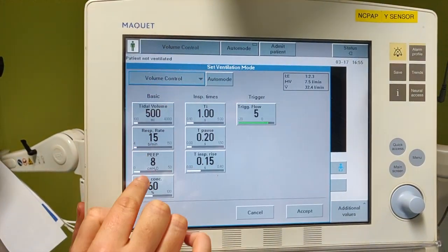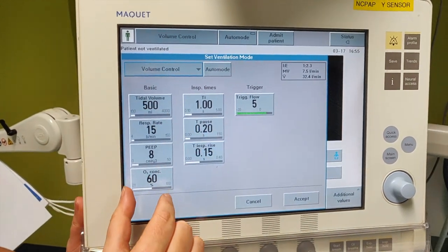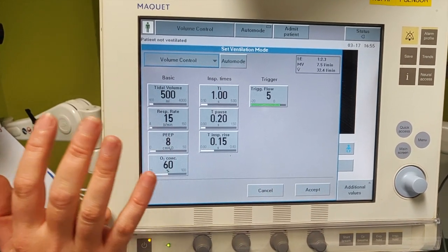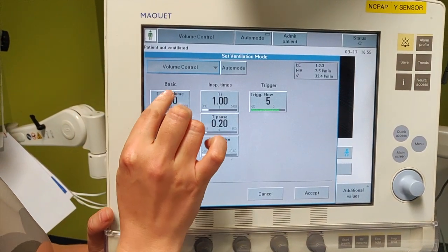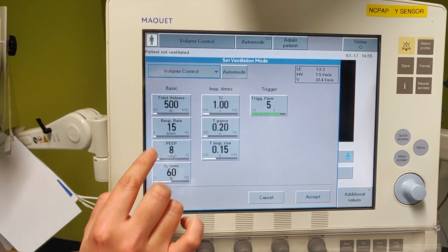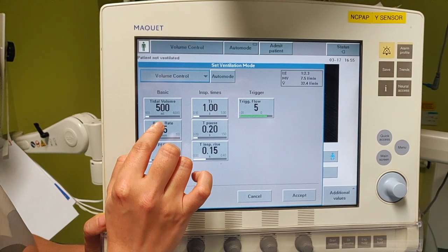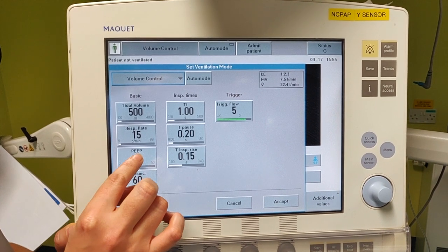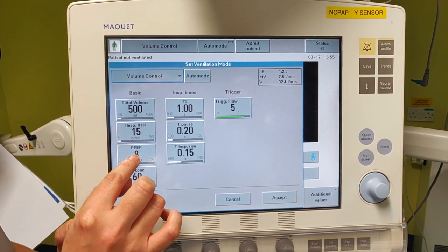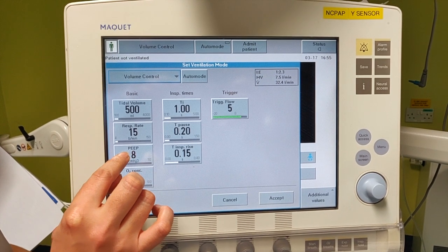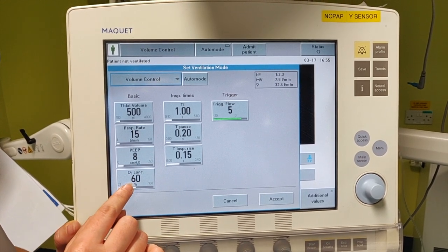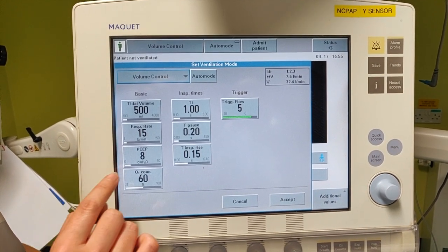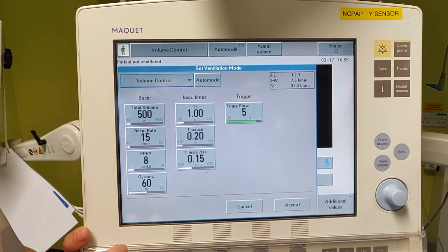We're going to look specifically at the parameters we need to set up in volume control. There are three main parameters. One is the tidal volume — the volume that goes in and out. The other is the respiratory rate, with the times that the air goes in and out. Then the PEEP, which is the pressure at the end of expiration — the pressure we need to keep the lung open. We also need to set up the FiO2, the fraction of oxygen delivered to the lungs, which you know well from other devices.